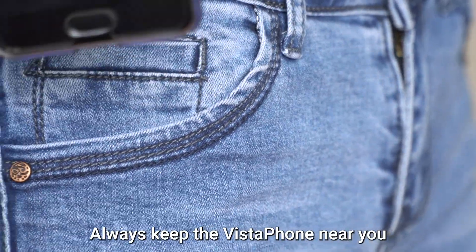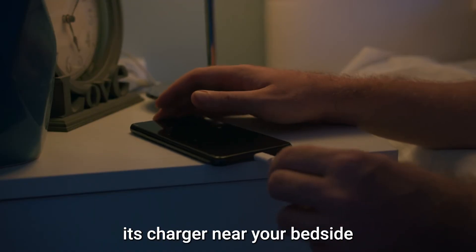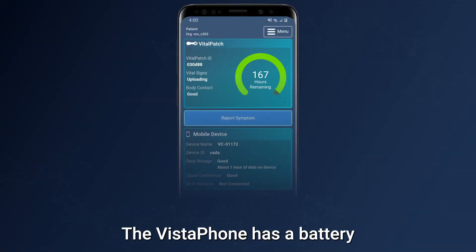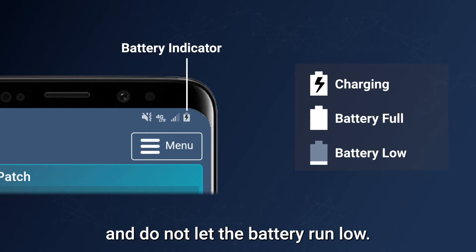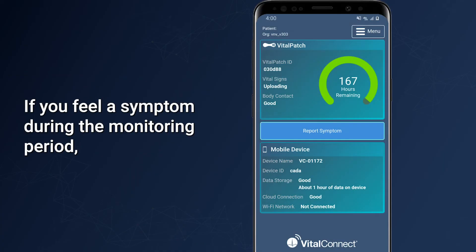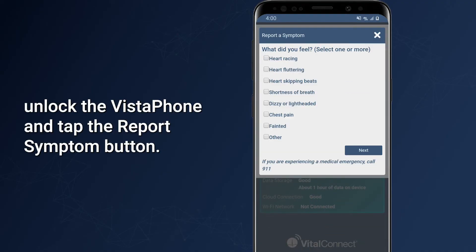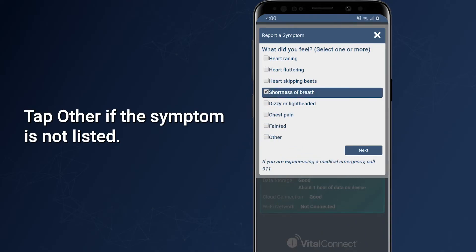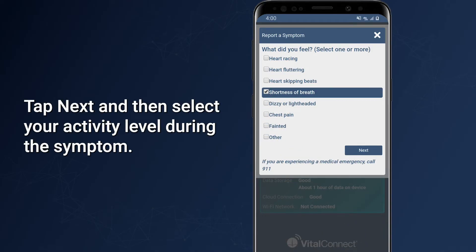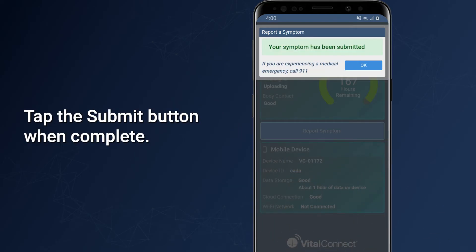Always keep the Vistaphone near you during the monitoring period, and keep it plugged into its charger near your bedside while you sleep. The Vistaphone has a battery indicator at the top of the screen — check it every day and do not let the battery run low. If you feel a symptom during the monitoring period, unlock the Vistaphone and tap the Report Symptom button. Select your symptoms from the list, or tap Other if the symptom is not listed. Tap Next, select your activity level during the symptom, then tap Submit.